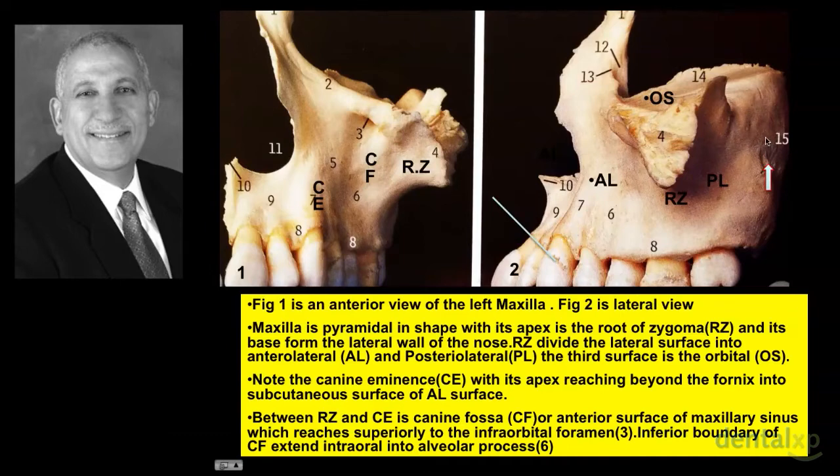That surface is really the anterior wall of the so-called infratemporal fossa. And if you extend your periosteal elevator, you can dig all the way into that wall. That wall is the anterior wall, as I said, of the infratemporal fossa.